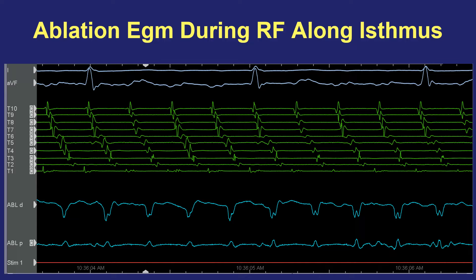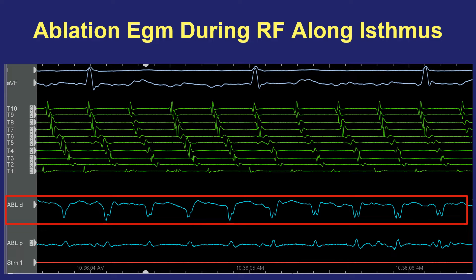Another useful piece of information during energy application is watching for the development of a double potential. During atrial flutter ablation, a signal that starts as a single electrogram and then begins to split into a double potential suggests a line of block is forming on the cavo-tricuspid isthmus. The wider the double potential, the more it suggests complete block at that location—so you'd search for a single bipolar potential instead of a wide-spaced double if looking for a gap in the ablation line.